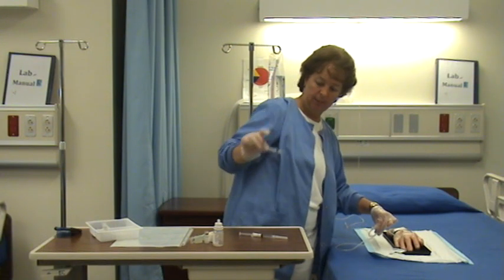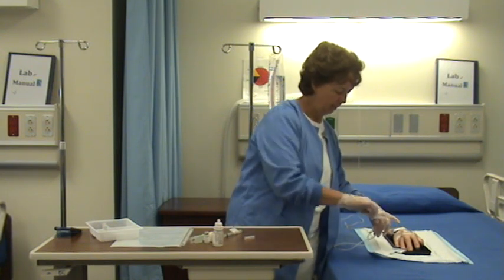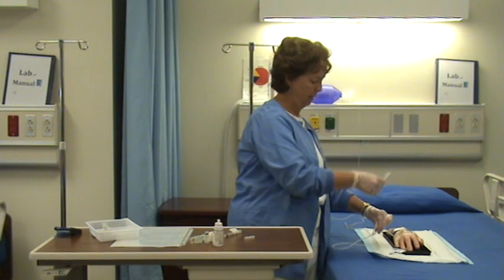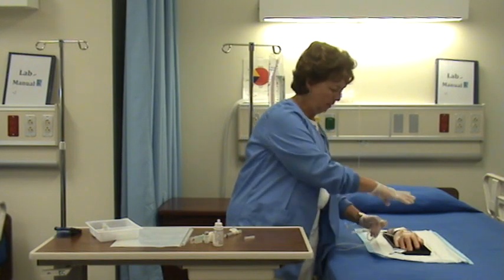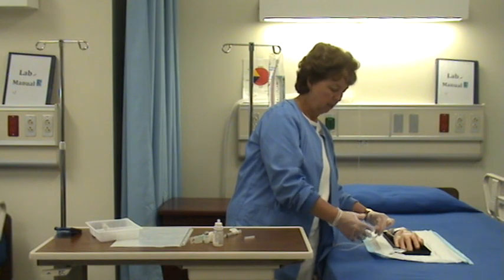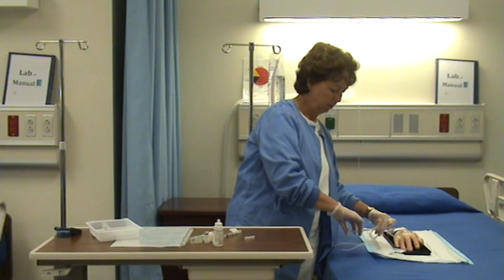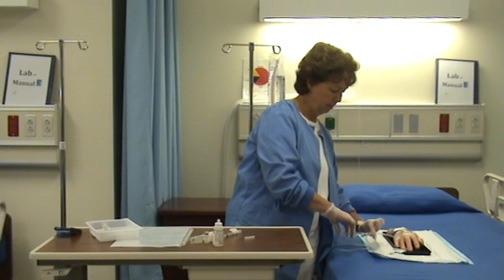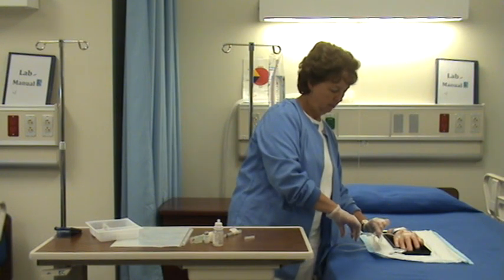Okay, and then this would go directly into sharps. And now I want to flush it with my saline. Again, like I said, you could open this up and let the IV flush it. But I want to be present while this continues to go in. So I'm going to initially inject this at a slow rate because you're continuing to give the Lasix. It's still in that tubing. As you can see, actually, you can see because the Lasix was discolored. You can still see it in the tubing.